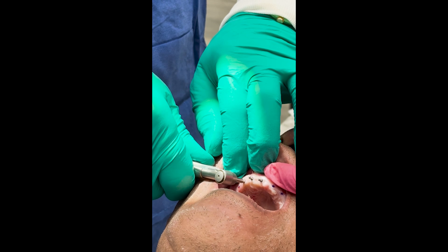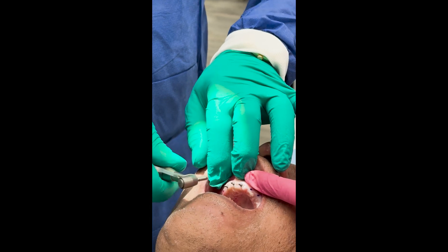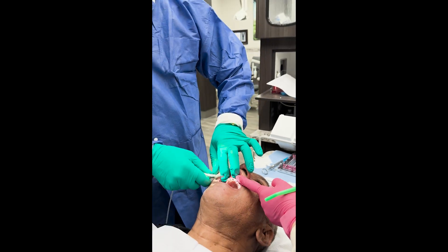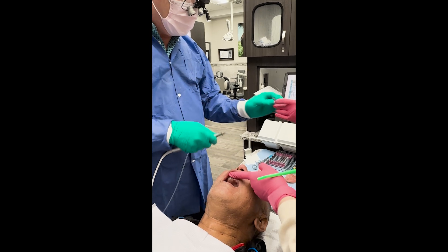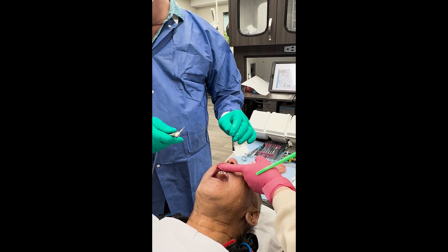Now we're going to go to 60 and we'll get it down the rest of the way. It's got very good bone — it beeped at 30 but it's probably more like 50 newton centimeters of torque because we got way past 30. And now we're going to go to the next implant.